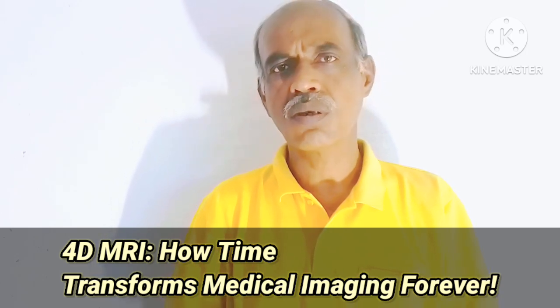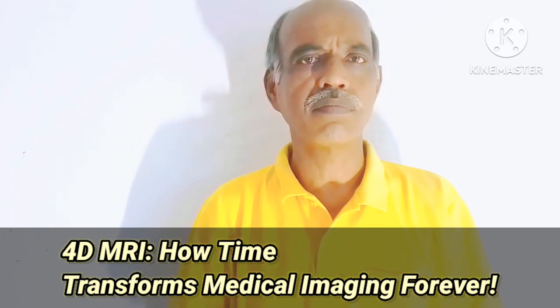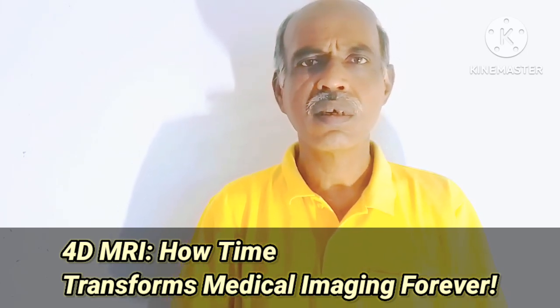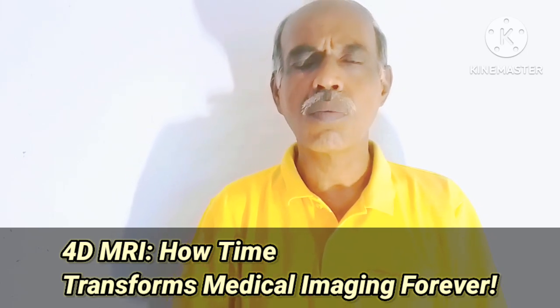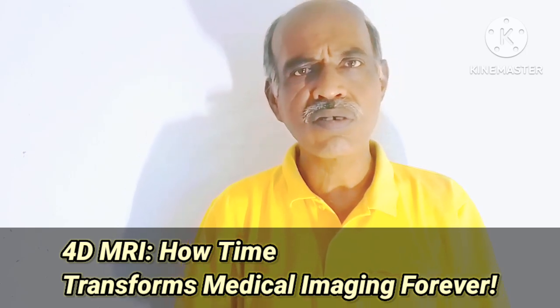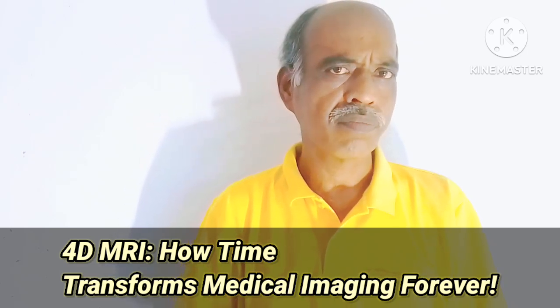Suppose doctors, meaning cardiologists, want to see the heart beating in real time. Suppose pulmonologists want to see the contraction and expansion of lungs in real time. And oncologists want to see how tumors shift during breathing.